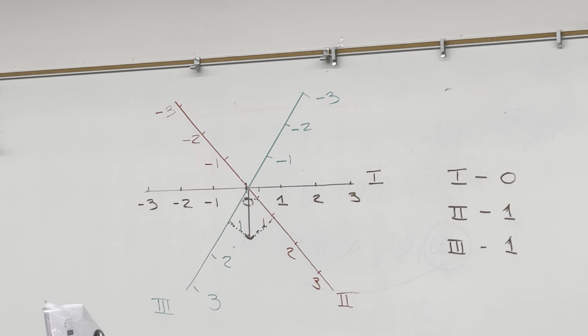This is vector cardiography. This is why you can be looking at exactly the same electrical activity, but you're always looking at it from different directions. And so the electrical vector that's being created by the activity of the heart is going to be interpreted differently depending upon where you're looking, the direction from which you're looking. What do you guys think?